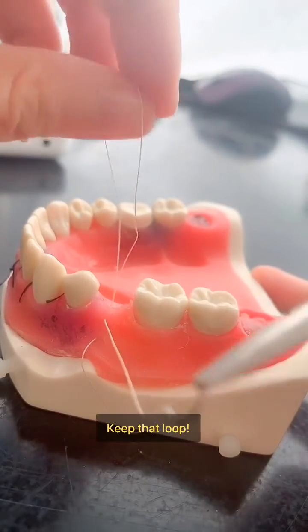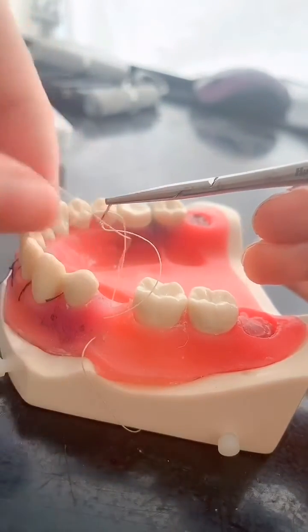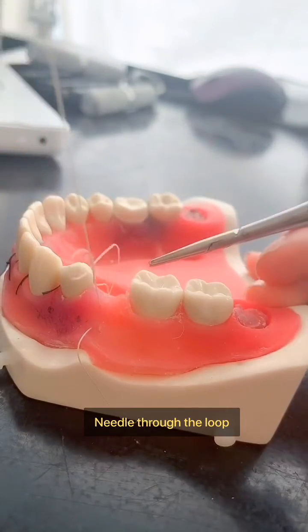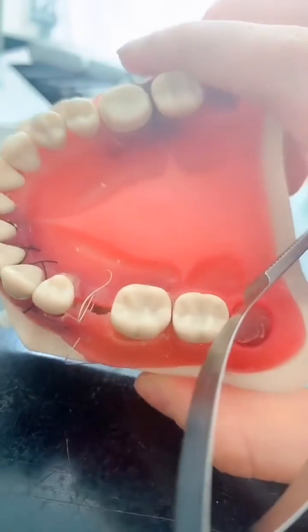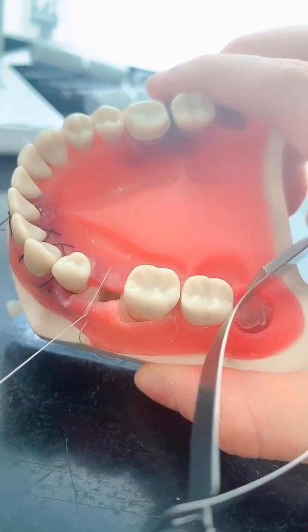The important thing here is to keep this loop — not to pull it all the way through — so that you can put this needle through the loop like this.